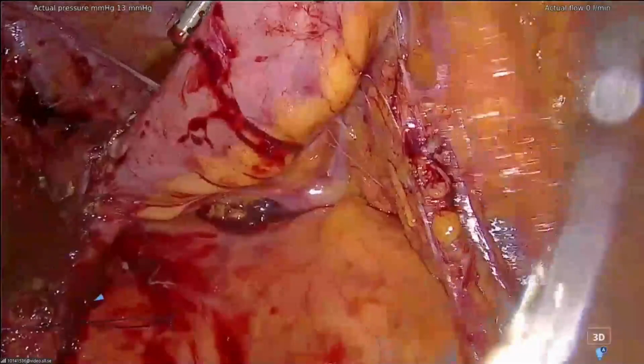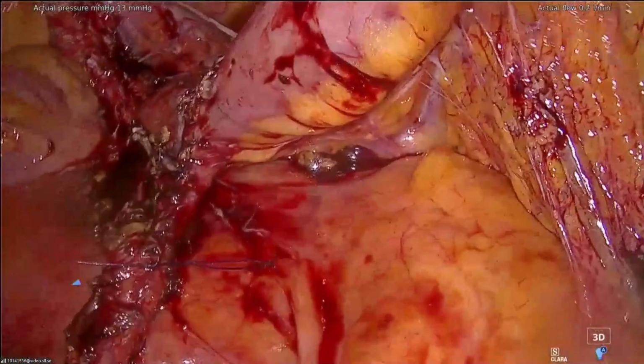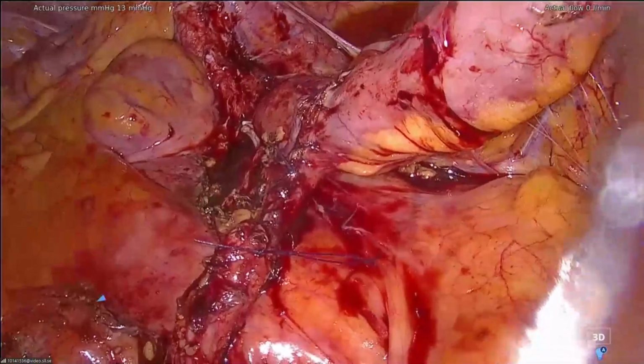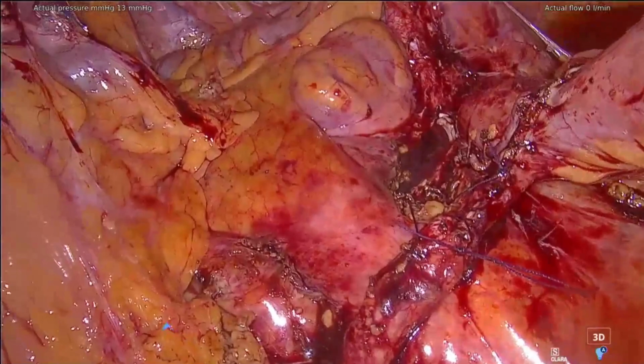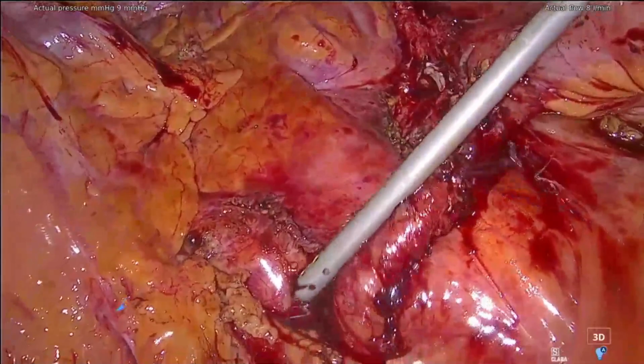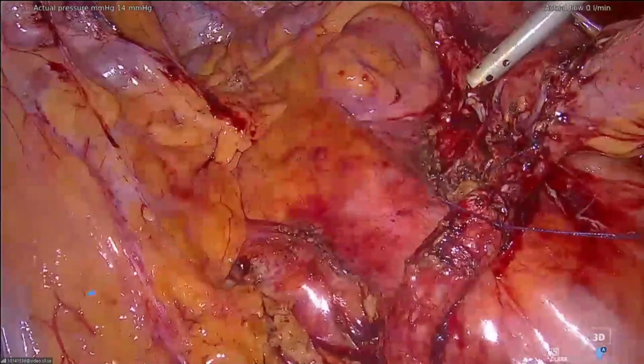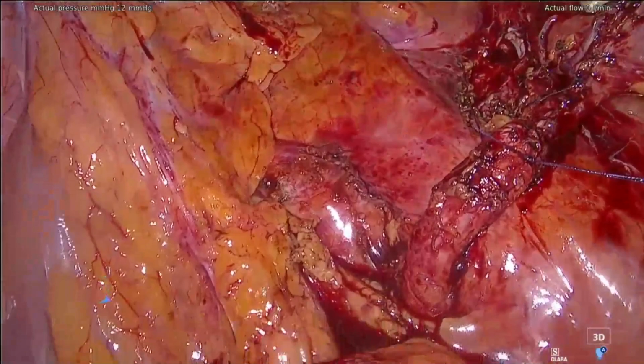Would you consider checking the watertightness of your procedure, sending saline, washing? Yeah, I know. I'm not a good friend, but you know. Do you have a bladder catheter? I want to put a bladder catheter inside to put water, please, to see if it's watertight or not. No, you can send from the nephrostomy tube. It's true. We can inject in the nephrostomy tube. Okay, but in the nephrostomy tube, you cannot put all the bowel under pressure. That's the problem. Okay, we try with the nephrostomy. Can you close that? If it's not very good, we will inject inside the bowel itself.